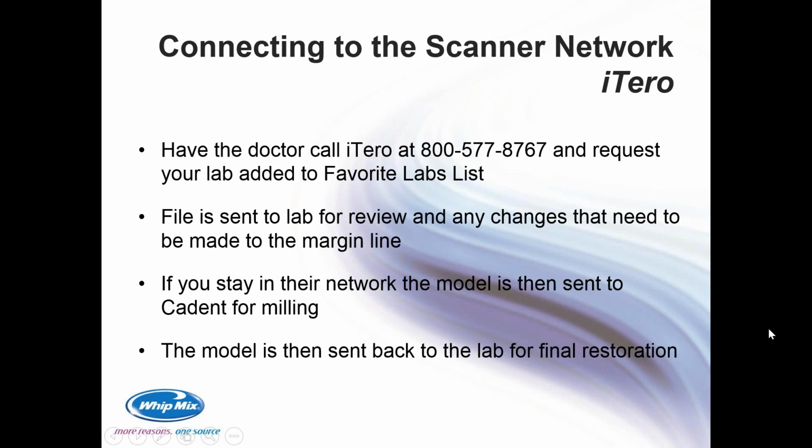With the iTero, you can have the doc call 1-800-577-8767 and request your lab that's in theirs as well. It's called the Favorite Labs list, and have your lab be added to that list. In the iTero network, from a workflow standpoint, to note, the file is sent to the lab for review.